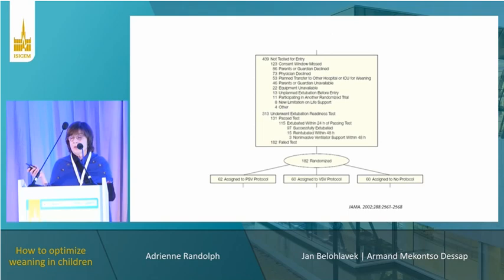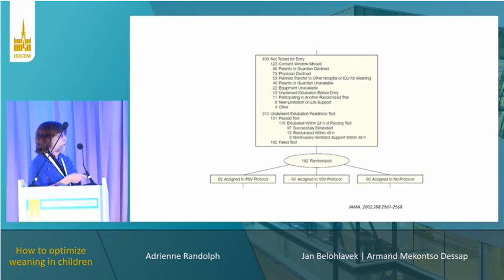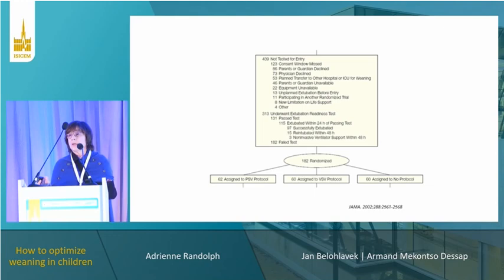Volume support was an automated mode on the Siemens ventilator that adjusted the pressure support to achieve a tidal volume, and then there was a no protocol arm. And what we found in the weaning part of it was no difference, because the amount of time in these weaning protocols was so short, like 2 days, it was hard to say that a few hours were going to really make a difference, because children tend to recover very quickly.